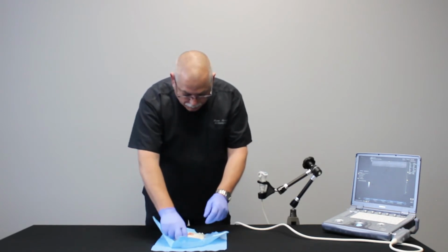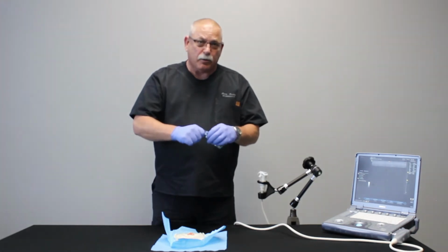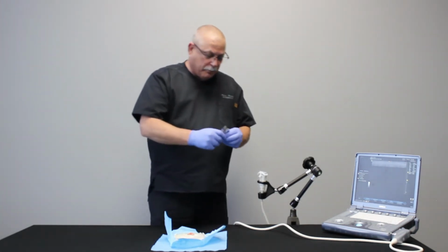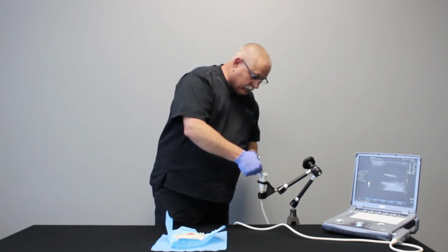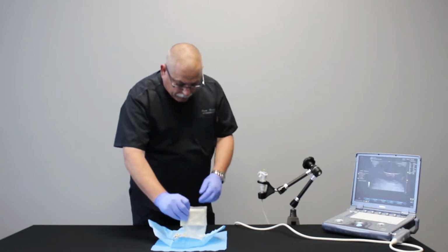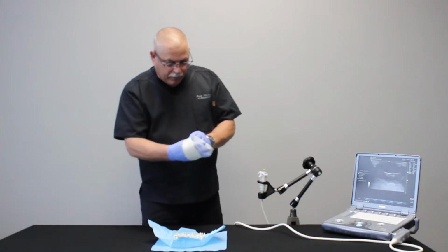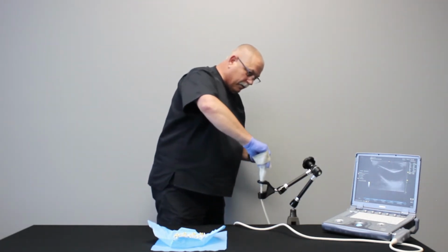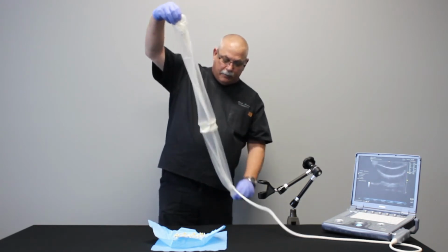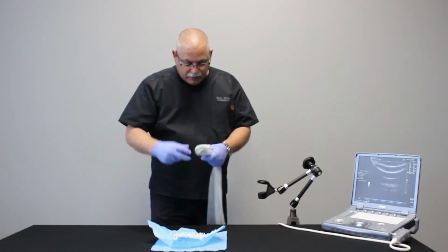First, I'm going to put gel onto the transducer. You can put gel into the probe cover itself prior to putting it on. That's a personal preference. I prefer to put the gel on the probe itself. So gel right there on the end of the probe. Then I will take the probe cover, place my hand in the middle, and grasp the probe, take it out of the holder, and pull it down the length of the cable. Then use the elastic bands to secure the cover.